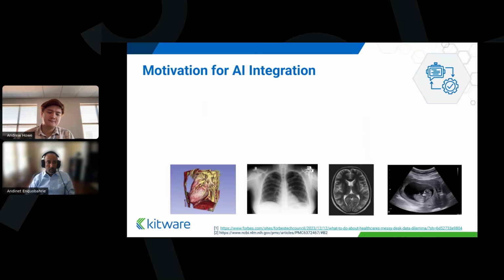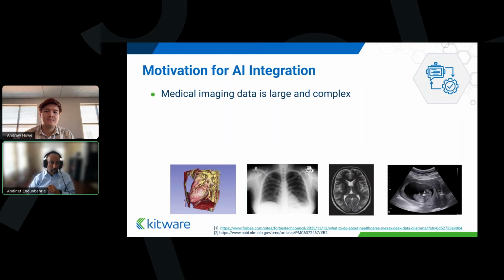Great. So why are we interested in integrating AI into VolView? What's driving this integration? The answer is related to the complexity of medical image data in the radiological community. The amount of data being generated is exploding.